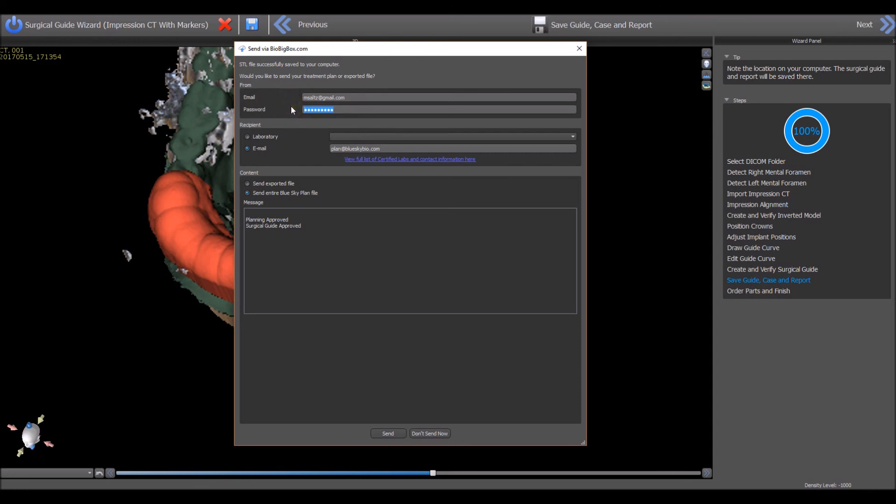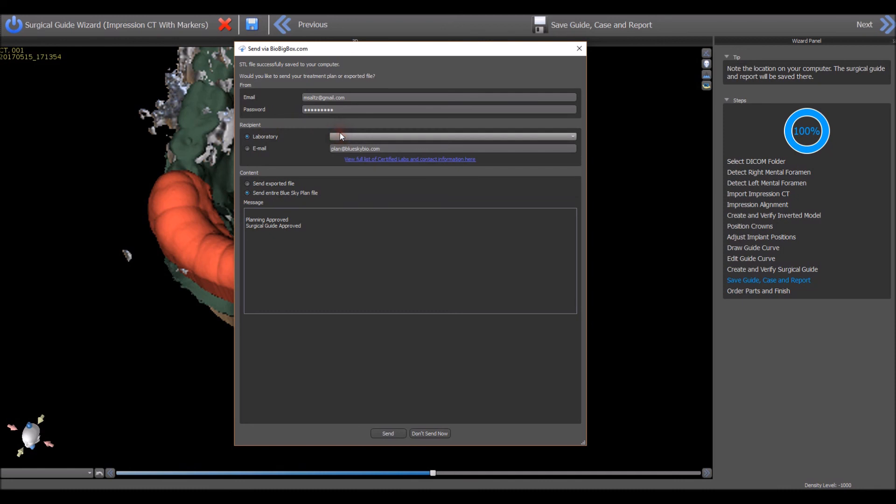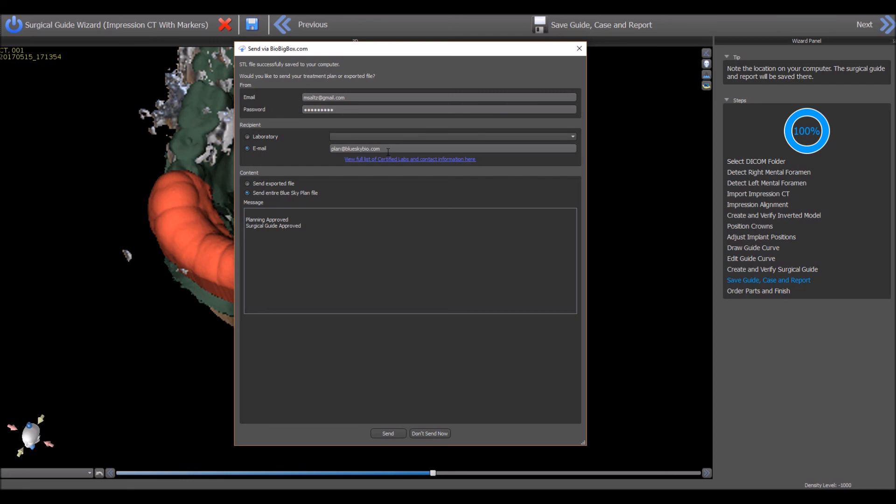Select laboratory and one of the labs on the drop-down list to send the case to a certified lab. Or select the email option and enter any email address to send the case to anyone with an email address even if they do not yet have a BioBigBox account. Select the option to either send the exported surgical guide or the entire BlueSkyPlan file. Include any relevant information in the message box and then press the send button.